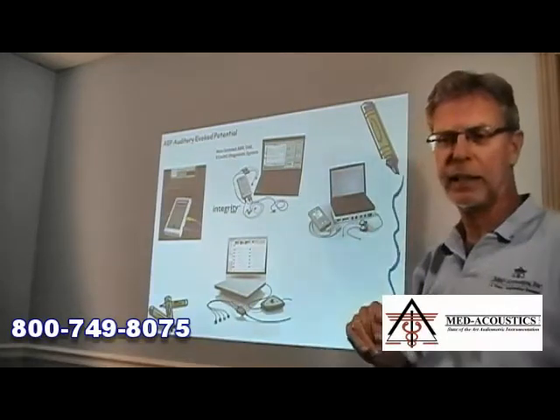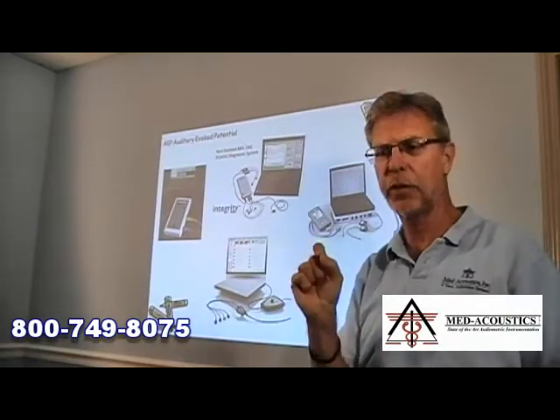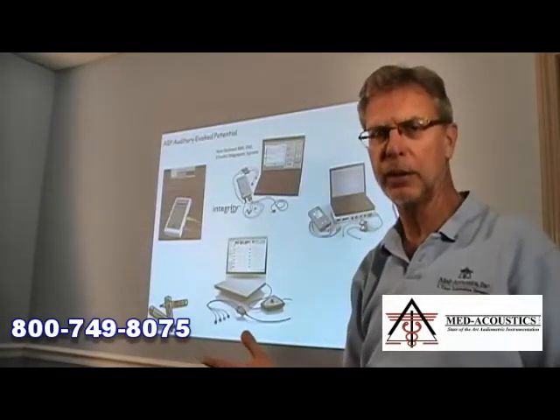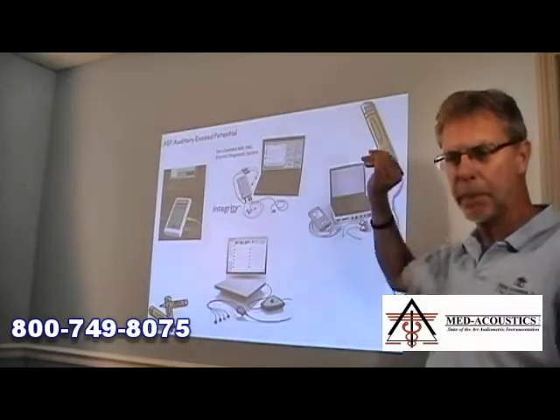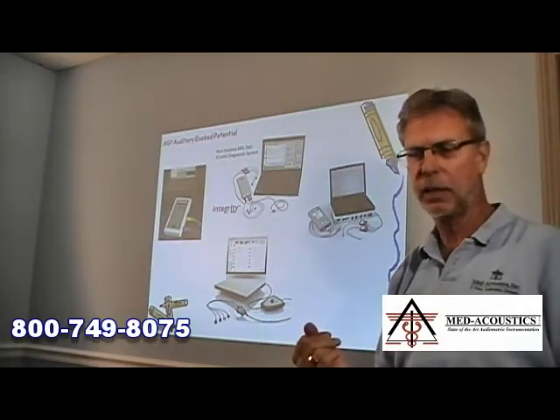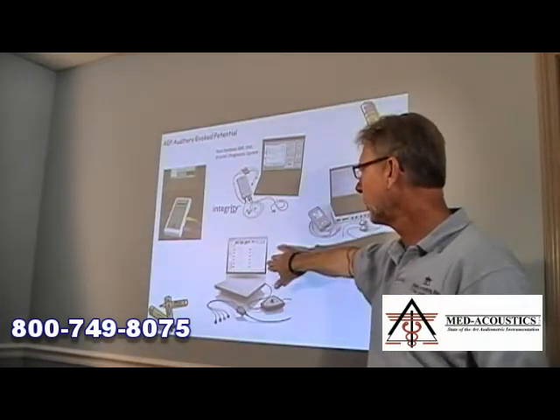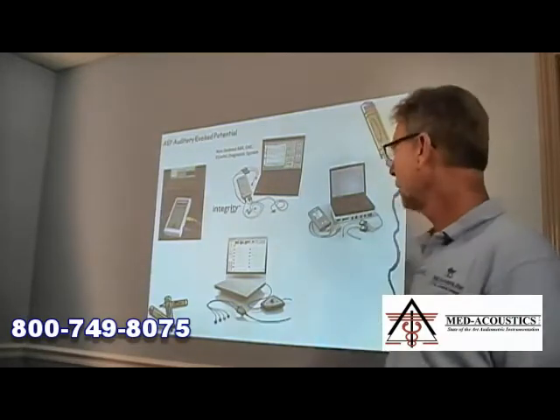The Vivosonic Integrity, specifically made for pediatric non-sedated ABRs, is a very good choice in the proper application, the proper facility. In some places, it's not quite appropriate for what they do. In other places, it could be the most appropriate thing. Then there is the Grason-Stadler Audera, and that's probably the second most commonly found clinical auditory evoked potential system that one would find in use in the United States. And then one we're talking about today, the Interacoustics Eclipse, and I'll show you what the benefits of that are. Okay? It's a PC-based unit.